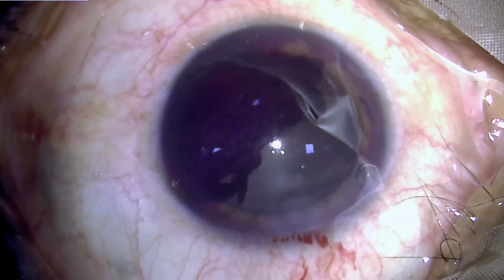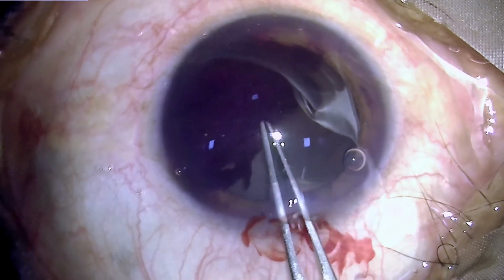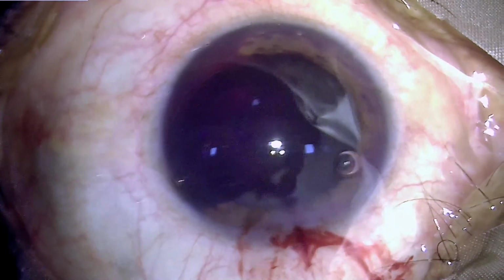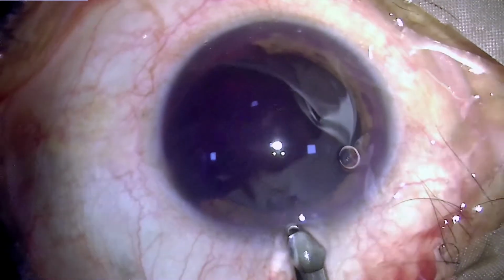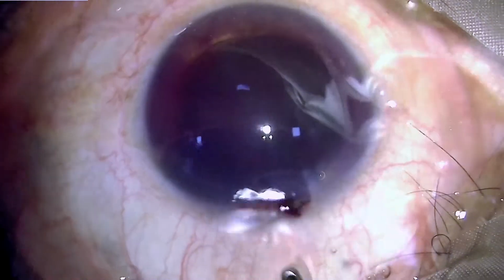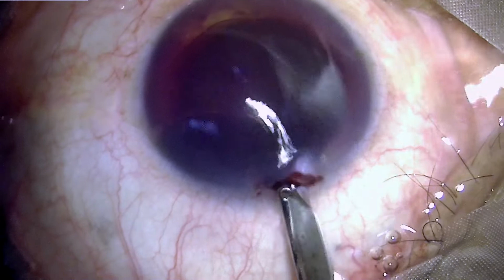Here an entry has been made which is not exactly 2.8 millimeters, which was the size of the keratome, but instead it is just an opening which will allow passage of a Simcoe cannula with no leakage. The clot cannot be pulled out using a rhexis forceps because the clot is cheesy and it simply cheese wires when it's held with a forceps. Rather, the better strategy is to hold it using vacuum, using either an irrigation aspiration handpiece. Here we are using a Simcoe cannula, which is far safer and well controlled, being an unmechanized tool.